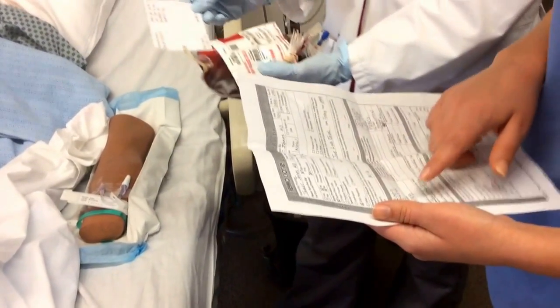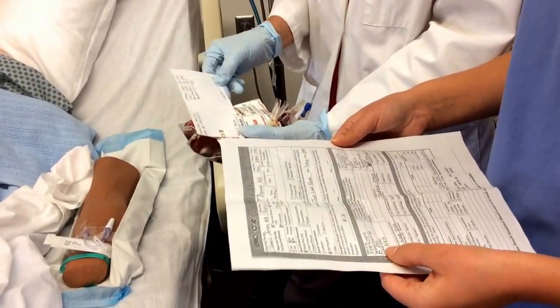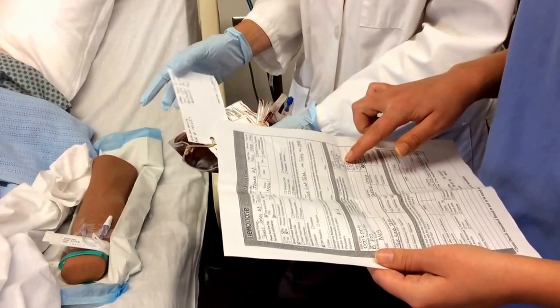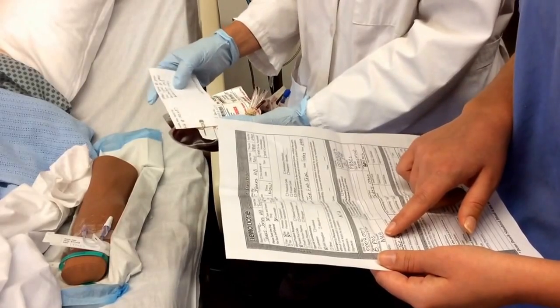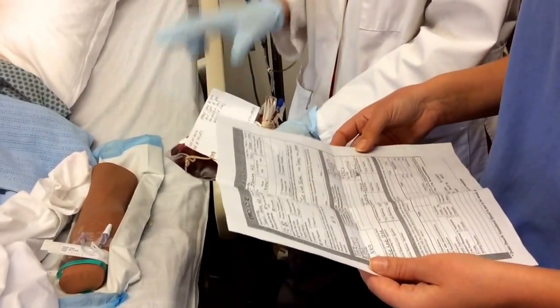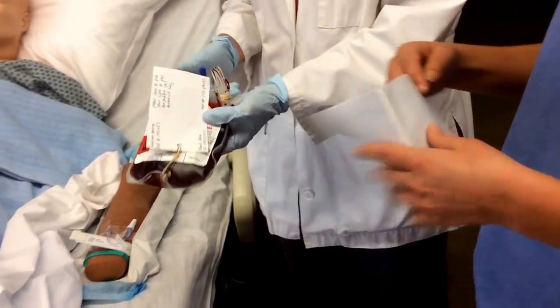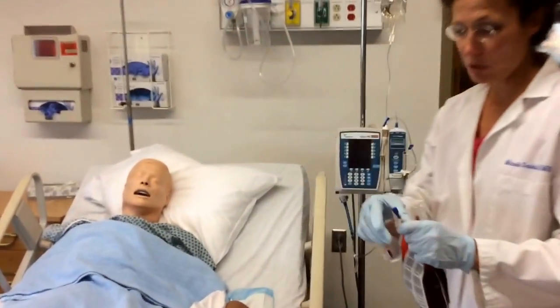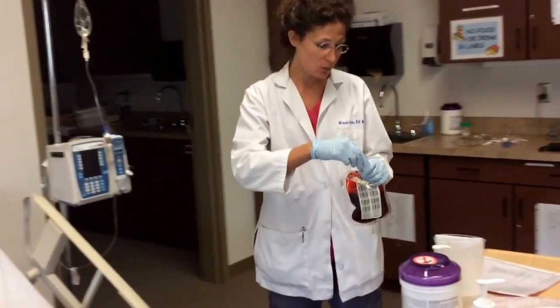0002009. All right, and now for the rest of the unit, the patient is B positive. B positive. The unit is B positive. B positive. The antibody screen for this unit of blood is negative. Negative, and it is compatible. It expires tomorrow. Okay, thank you very much. Okay, following the verification process, I'm ready to spike this unit of blood, and so we'll continue with that.